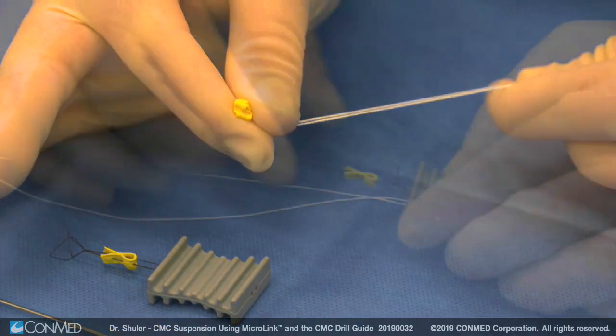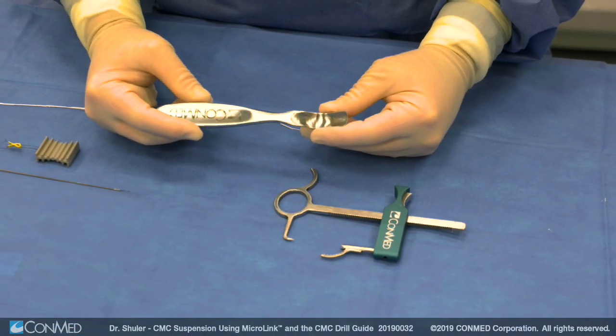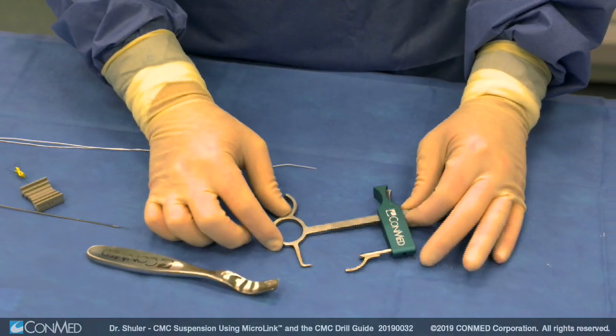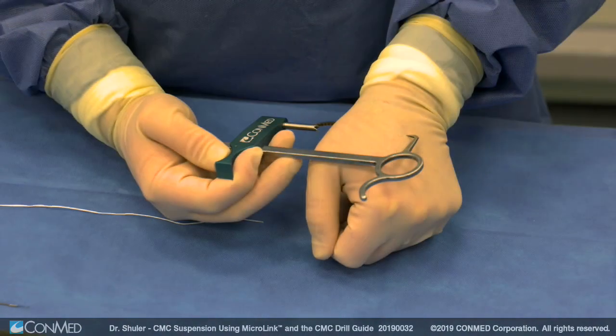The fourth instrument is the micro link backstop, which comes preloaded on the loader. The fifth is the McGlamory elevator, which allows for soft tissue elevation off the trapezium to allow for easier excision of the trapezium en bloc. The sixth is the CMC drill guide, available with or without a paddle.